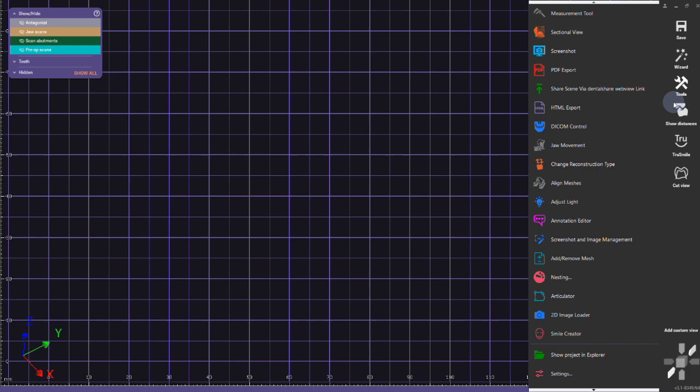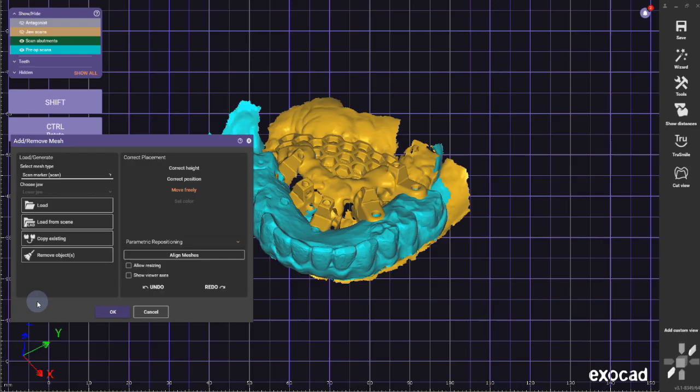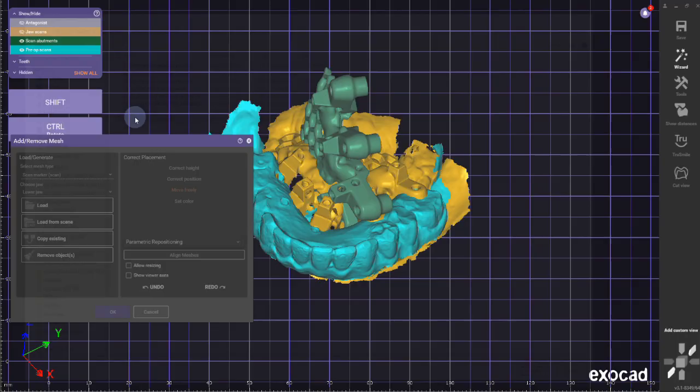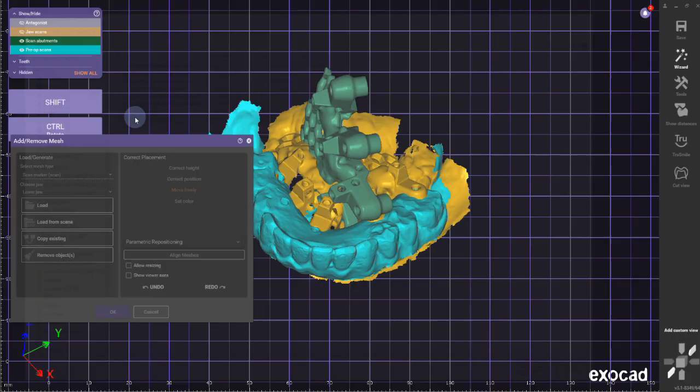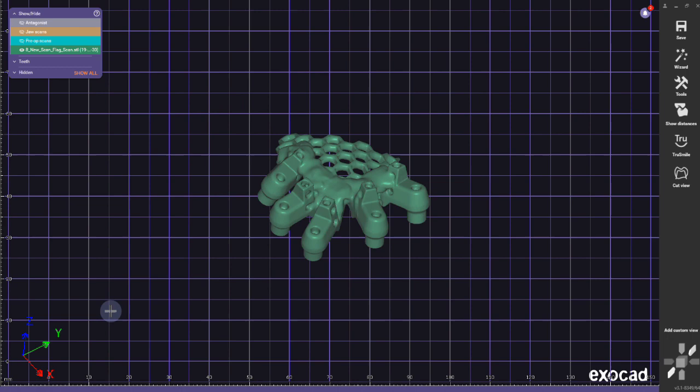So this part now I don't need anymore, but what I need to do is I need to go to import new scan marker scan. And when I click load, it will give you a warning and say, 'Yeah, this mesh already exists,' because I already have the IOS scan. But anyway, click yes here and import the file that you just exported.